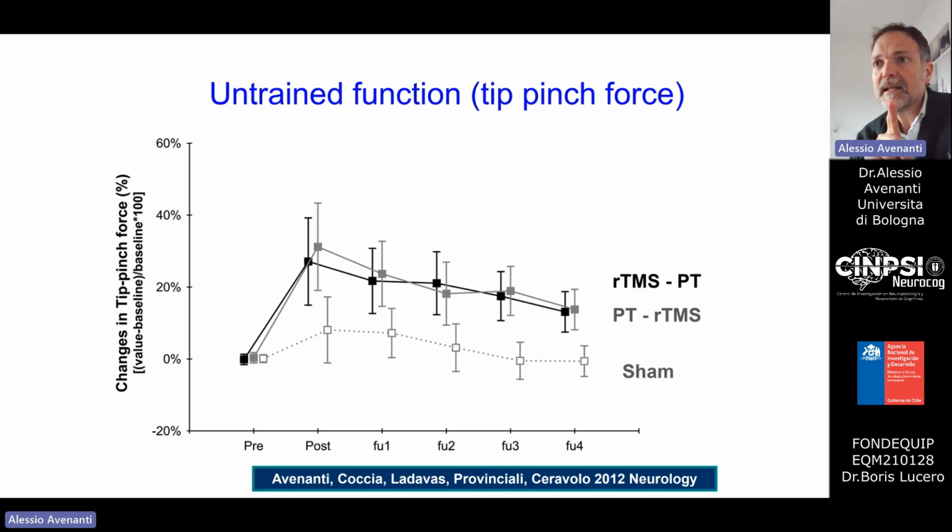In this graph, you would see, please let me say also, that participants received 10 days of stimulation. Every day for 10 consecutive days, they received a daily session of repetitive TMS, particularly inhibition of the healthy motor cortex, of the intact motor cortex, using low frequency rTMS. Okay. And then we tested participants just after these 10 days of stimulation.